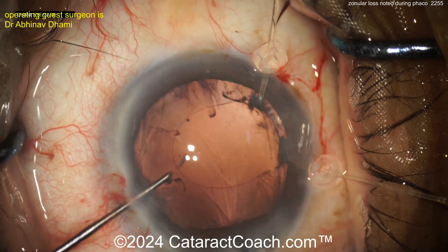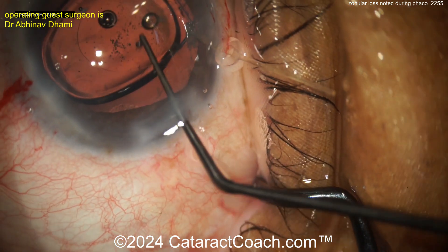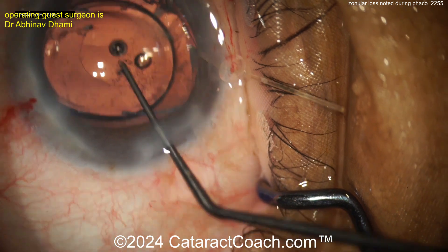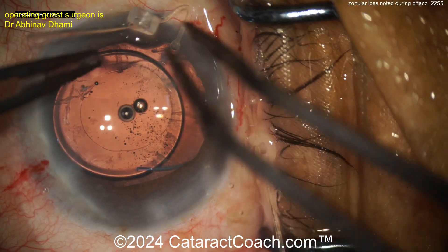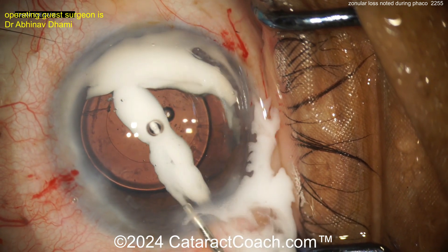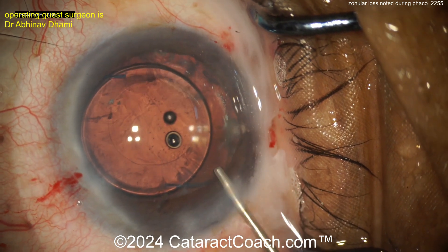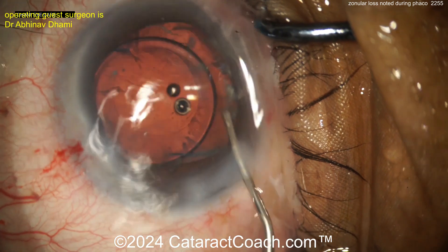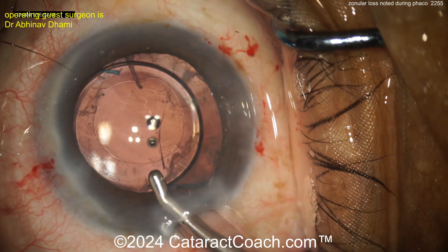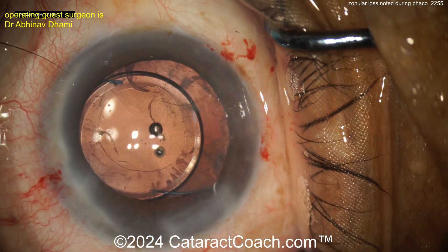Now you can probably take out your capsule hooks. But is the CTR going to be enough? Here comes the lens — it's a three-piece lens. It looks like it's in the bag. The extra bolster effect is achieved by placing the haptic where the area of zonular loss is — that can help. But this lens may not stay centered when you take out all the viscoelastic. You can also see there may be some prolapsed vitreous — that may be vitreous instead of cortex, those little strands right there. Got to be very cautious here.